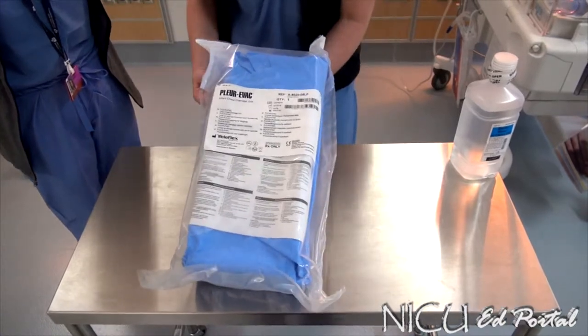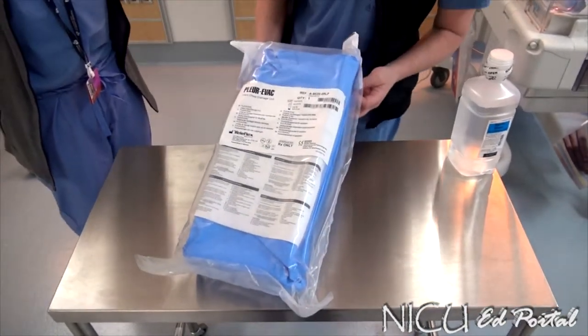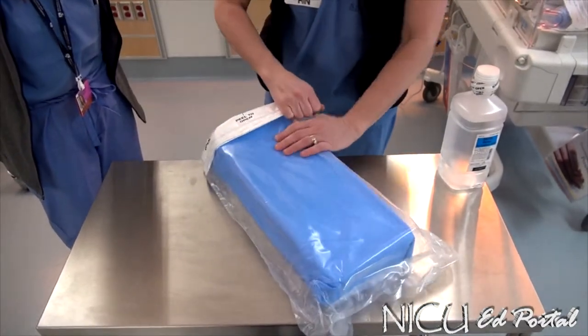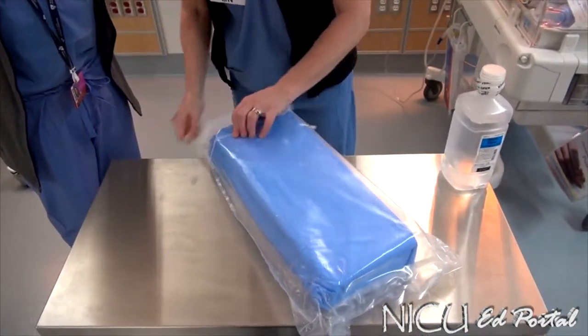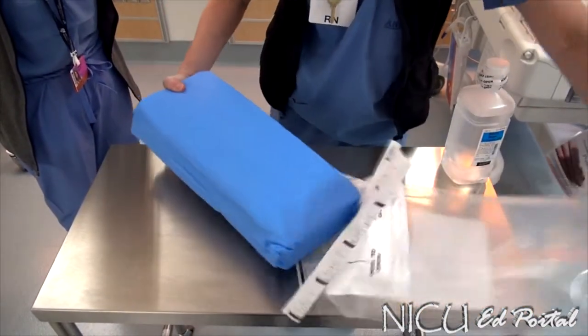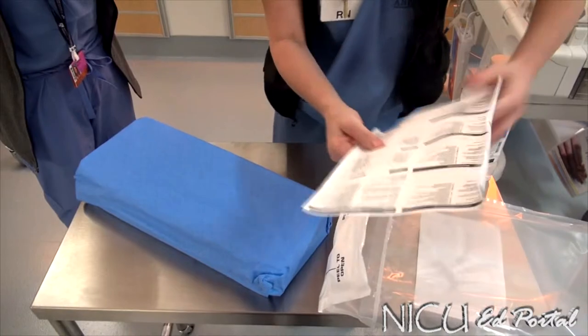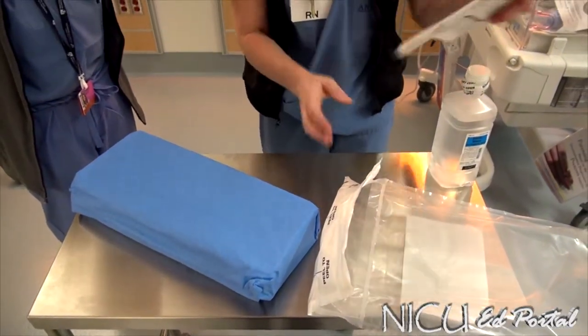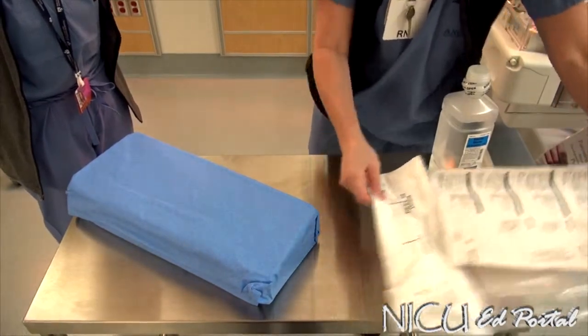For next steps, we'll walk through actually setting up the package. On the back, you can just peel to open. The insert will be here to identify each port and chamber, and it's very good to get familiar with that.